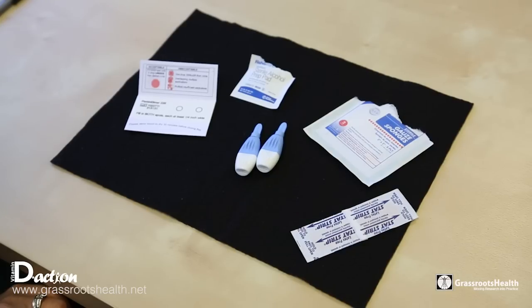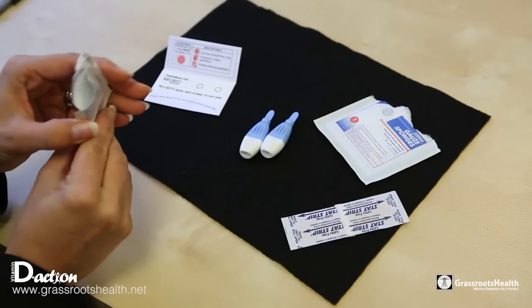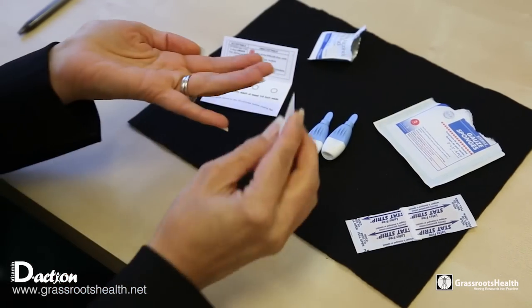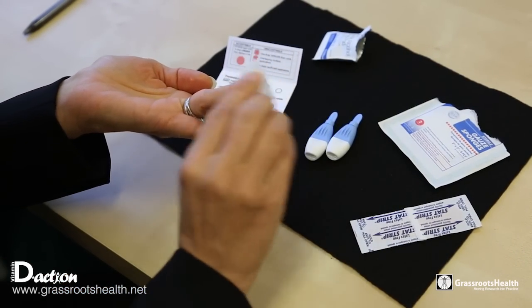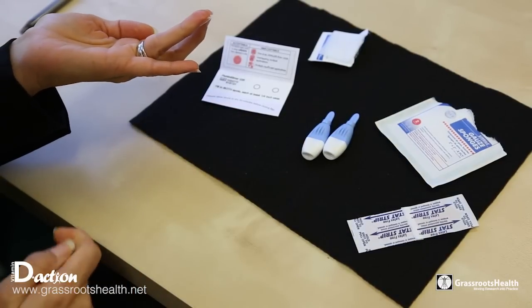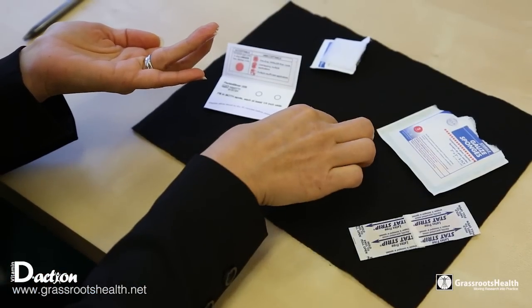Now you will go and wash your hands, and once you have done that, you will come back and open up the alcohol pad and wipe the finger that you are going to use for your blood spot. Choosing a finger on a non-dominant hand is generally a good idea, and you are going to use the lancet into the side of the finger.